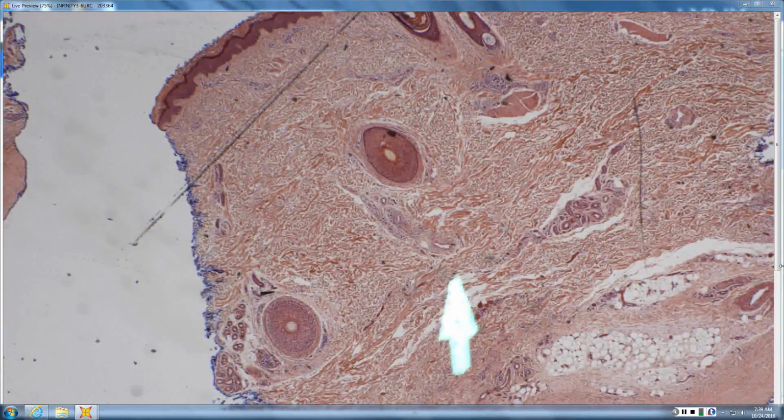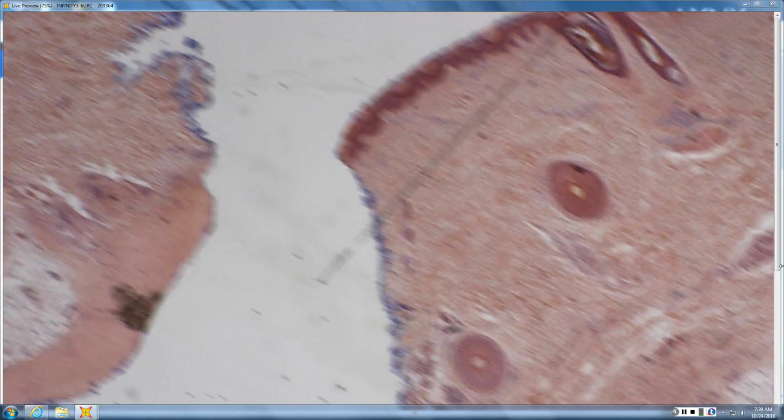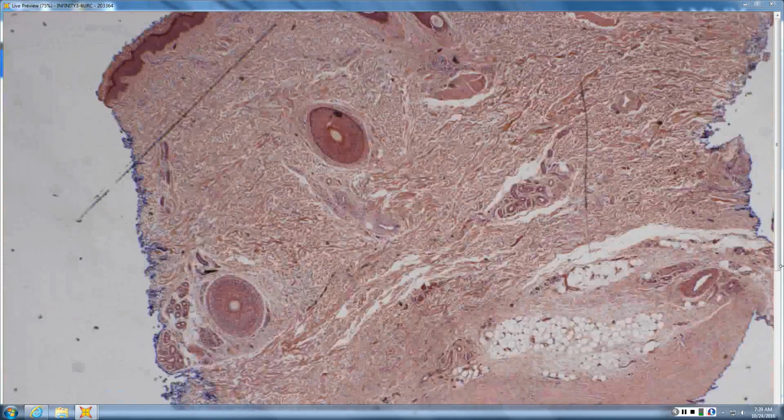Other thing, you have perivascular lymphoid infiltrate at the periphery of where you have the sclerosis. If you did a CD34 and you had normal CD34 all through there and it totally disappeared down here, maybe a morphea, like a morphea profunda, could do that. Why that's in this box, do not know.